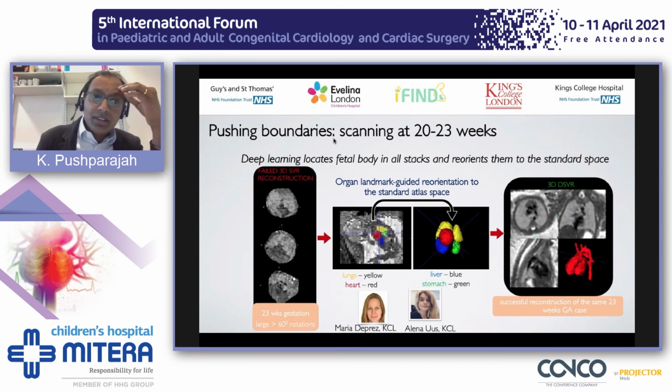And this is the same reconstruction algorithm that we use to produce those beautiful images at later gestation. But this is a 23-week fetus with a lot more motion, and we can polish it up to look like this. And so this is where we're going to be focusing on.